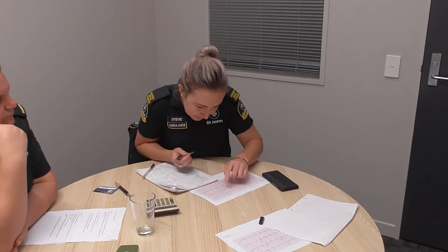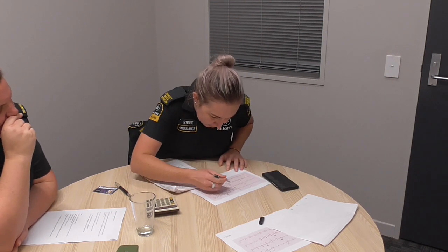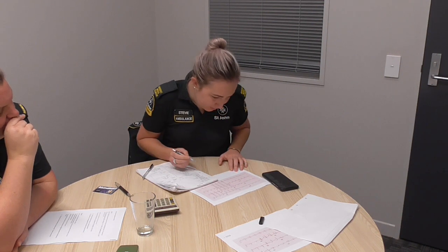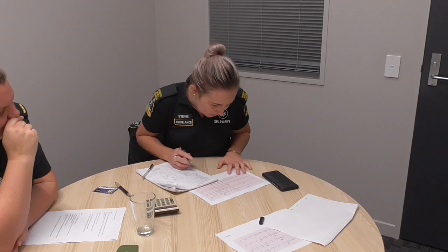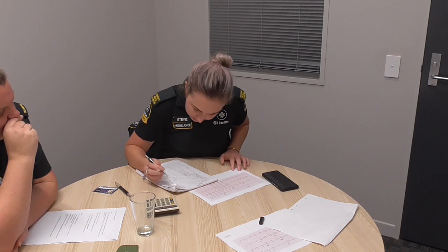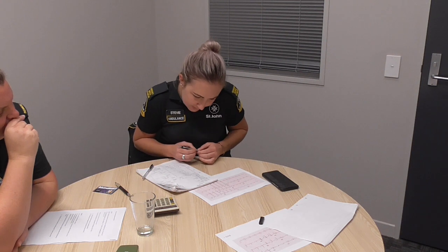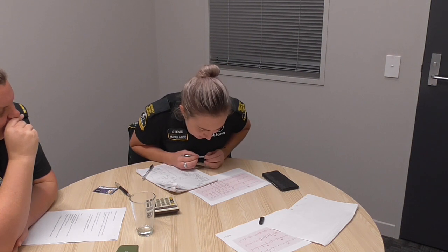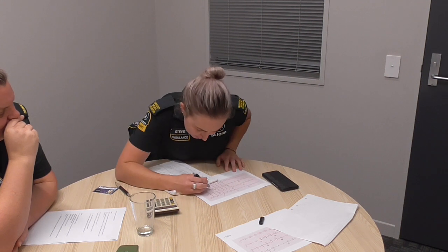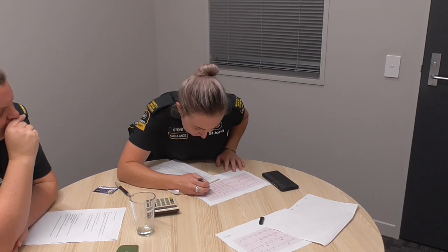ST segment, we've got elevation in V4, V1, V2, V3, with no reciprocal changes. We've got no depression anywhere. T waves. RSR.